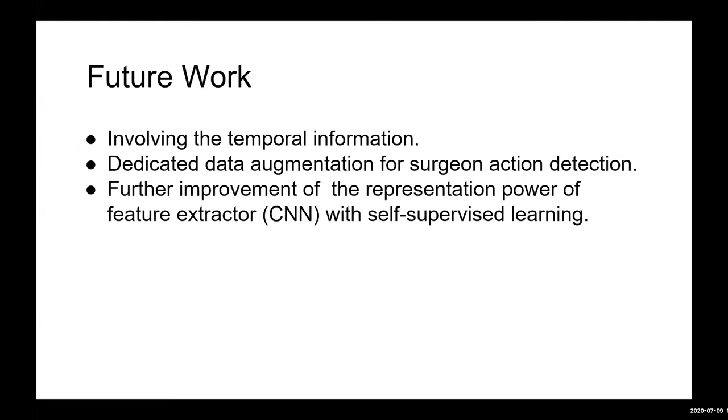For the future work, we are planning to do more research in the following directions. The sequence of the surgical procedure implies temporal information in the ESAD task, and involving temporal information could potentially improve the accuracy of the ESAD task. Dedicated data augmentation for surgeon action detection is desired, since surgical images have unique characteristics compared to other natural images. And last, techniques that improve the representation power of CNN, such as self-supervised learning, can be used in ESAD tasks as well.